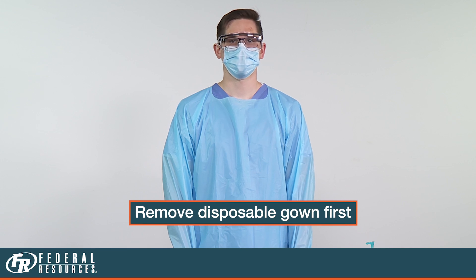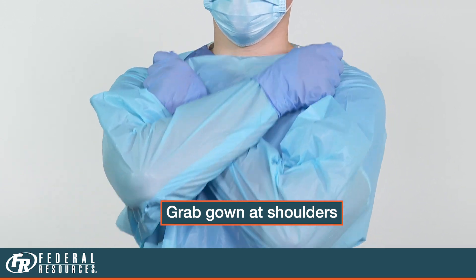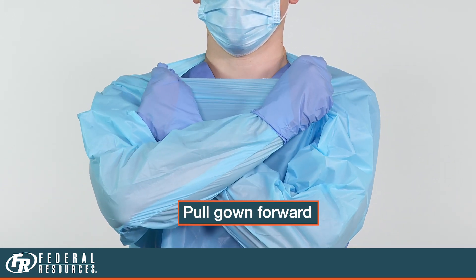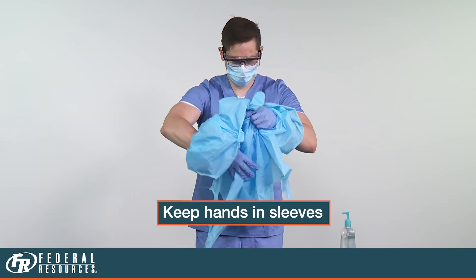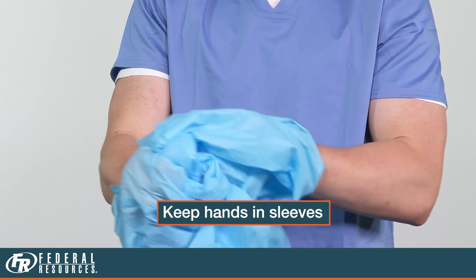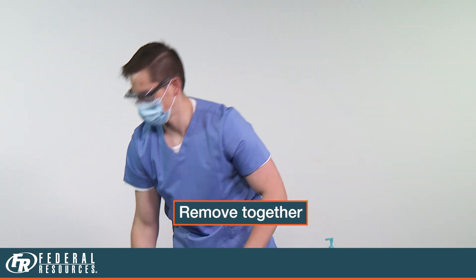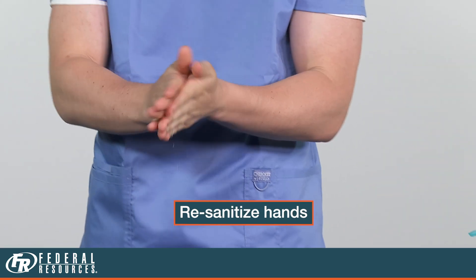The first piece of PPE to remove is your disposable gown. Give yourself a hug. Grab your gown at the shoulders and pull the gown forward from the shoulder area. Keep your hands inside your sleeves while you roll the gown away from your body, down toward the gloves. Remove the gown and gloves together as an entity. Now re-sanitize your hands.